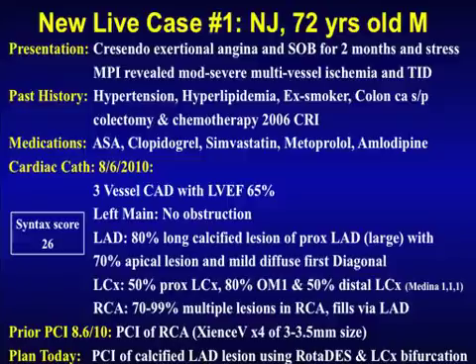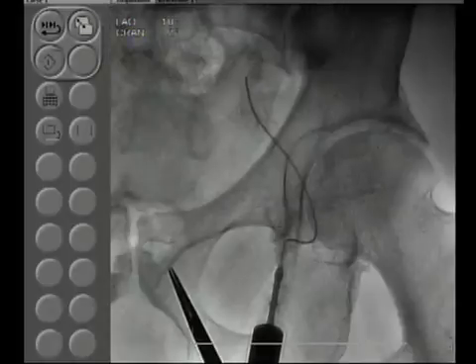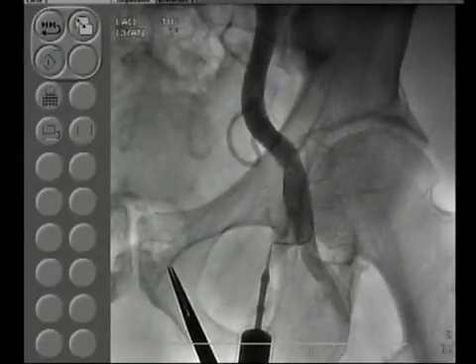At that time he had stents of the right coronary artery, and of course today he is here for the calcific LAD and bifurcation circumflex lesion. Therefore, Anu will go through the angiogram. Always when a patient comes back for staged intervention, the first thing is you need to check the status of your prior intervention, and this is where we will start now.